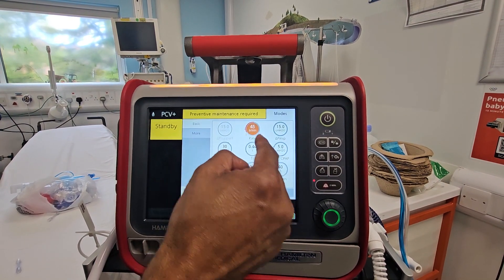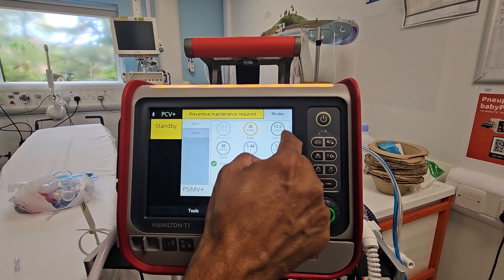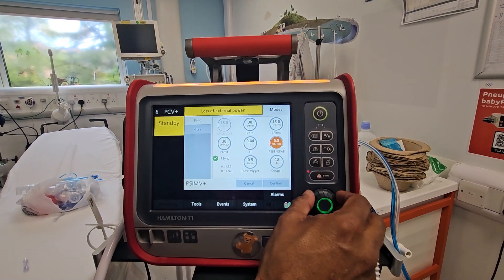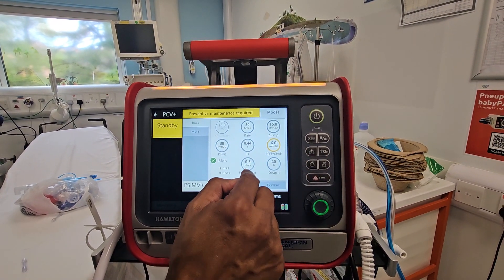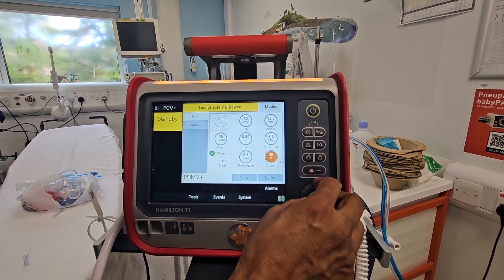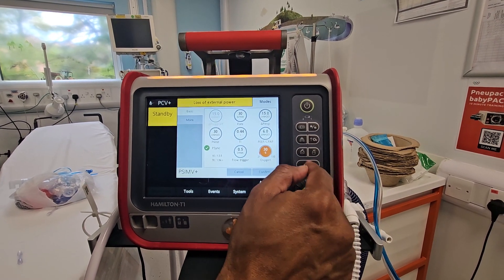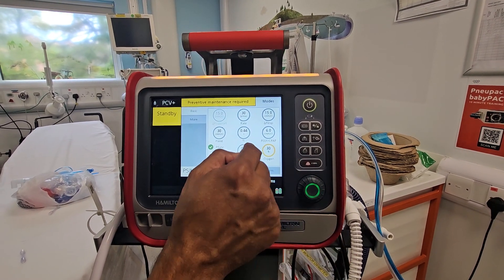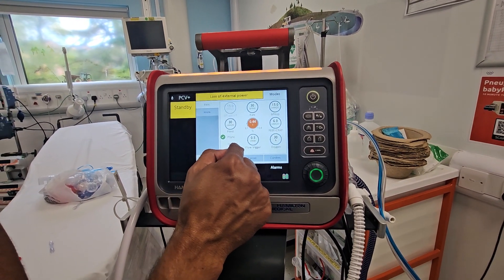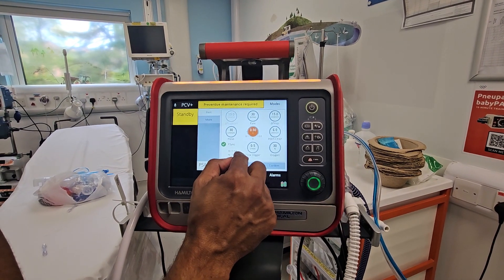To change a setting, click on it and press to confirm. I'm happy with the 20. Let's say I'm going to increase the PEEP to 6 — confirm that. You change your oxygen here; let's say I want to go down to 30%. If you're not connected to oxygen, the ventilator will remind you to connect to oxygen. This is your I-time; it will also show you the inspiratory-to-expiratory ratio. If I increase the I-time, the IE ratio will obviously change. Let's set it at 0.6 and confirm it.